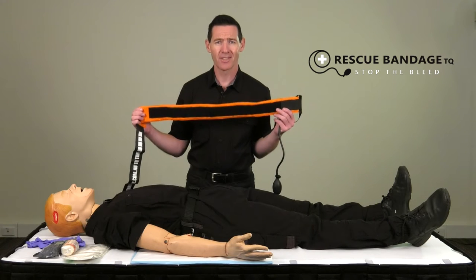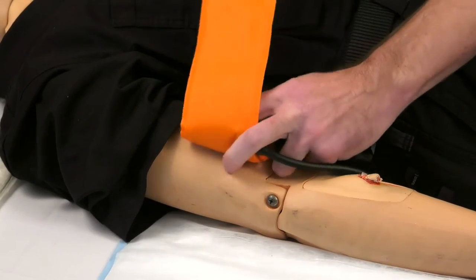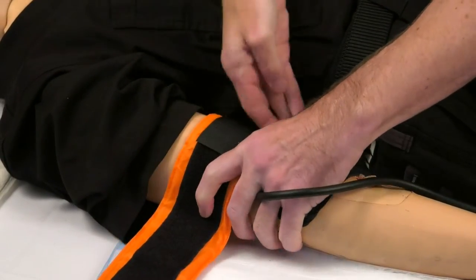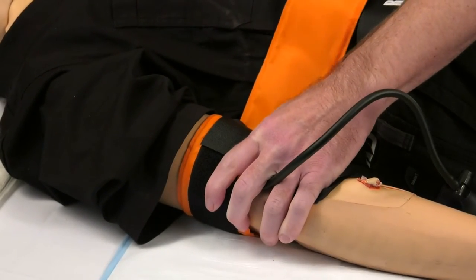Once you undo and extend the rescue bandage, place the end of the bandage with the inflatable bulb over the limb. Wrap the length of the rescue bandage around the limb so that it overlaps the bandage.